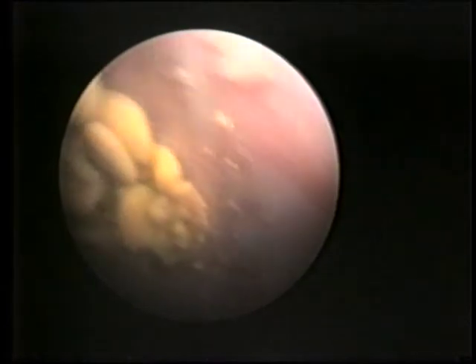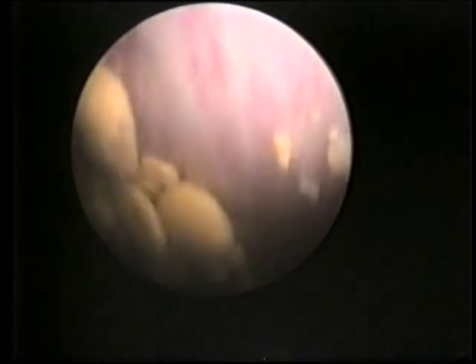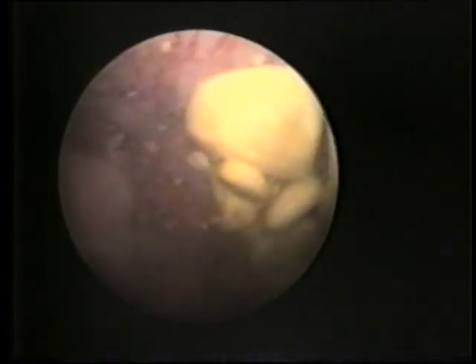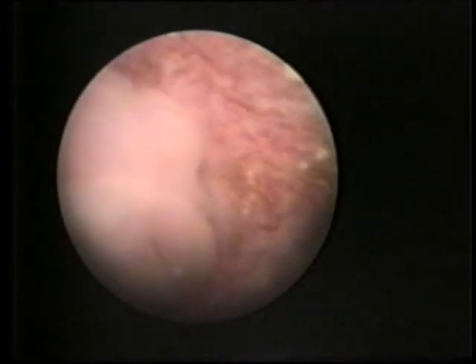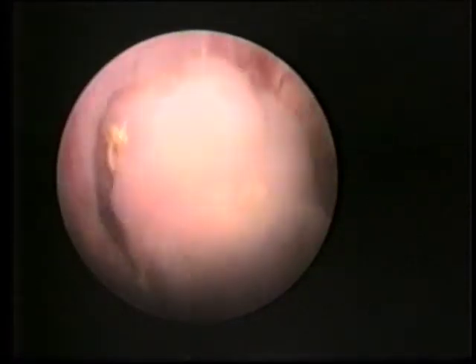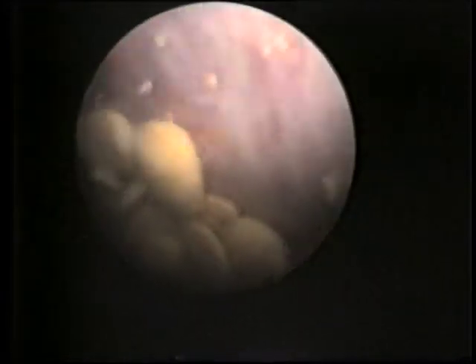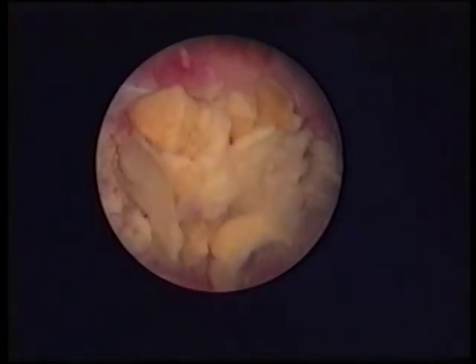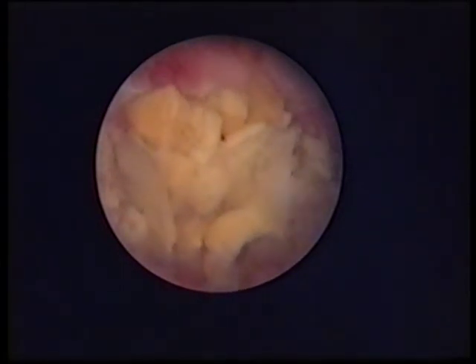Recurrent blocking of the catheter should alert the clinician to the possibility of bladder stones, invariably associated with urease-producing bacteria, such as Proteus mirabilis, which become entrapped in the stones and provide a constant source of reinfection. The dome-like structure indicates operative closure of the urethra had been performed to prevent urinary leakage.